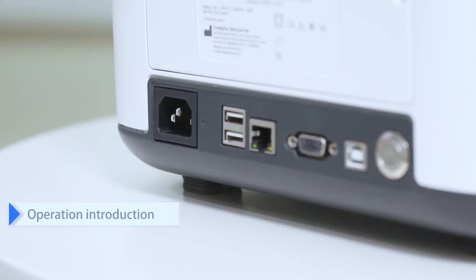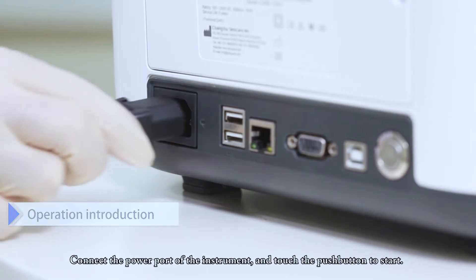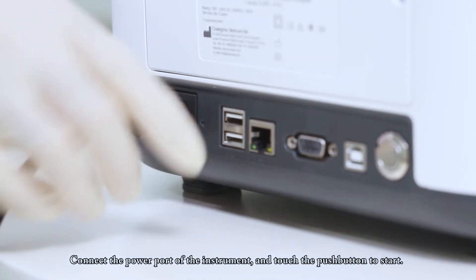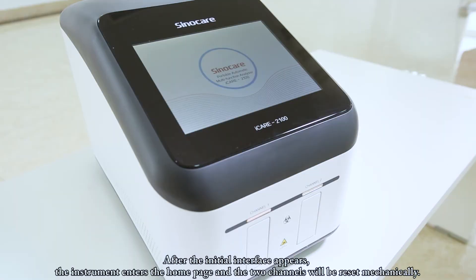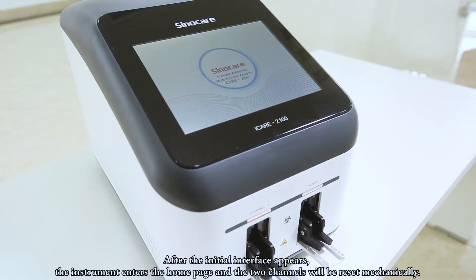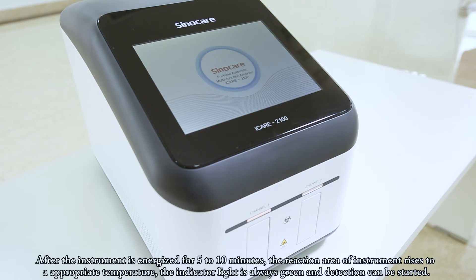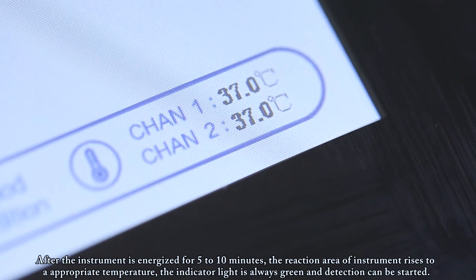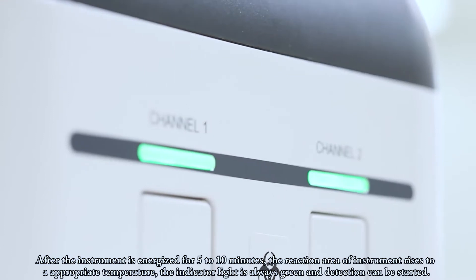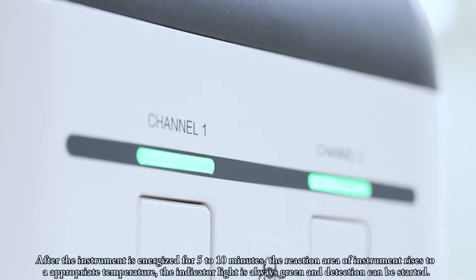Connect the power port of the instrument and touch the push button to start. After the initial interface appears, the instrument enters the home page and the two channels will reset mechanically. After the instrument is energized for 5–10 minutes, the reaction area rises to an appropriate temperature. The indicator light will be steady green and detection can be started.